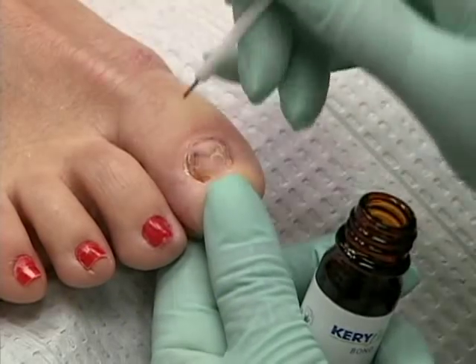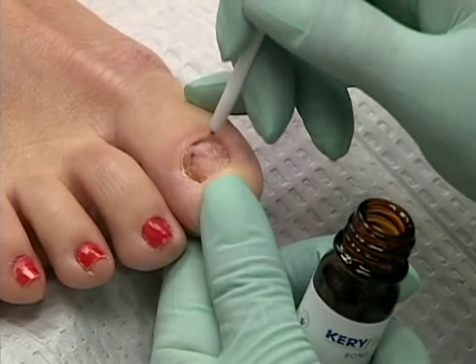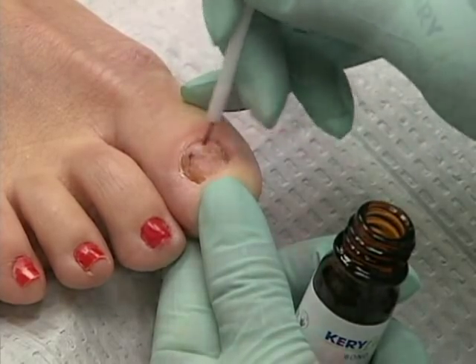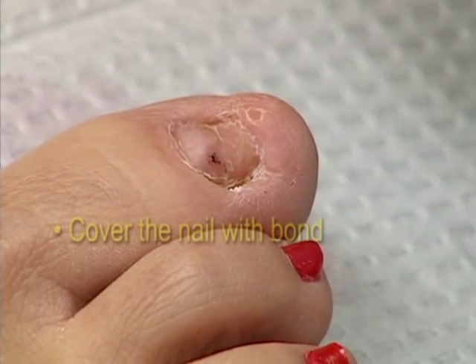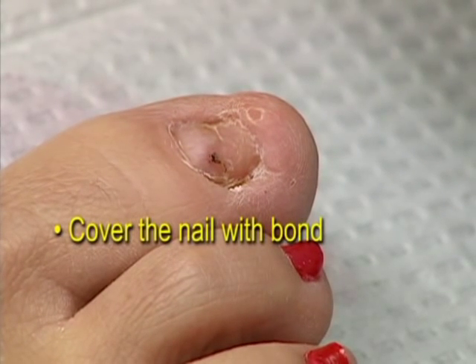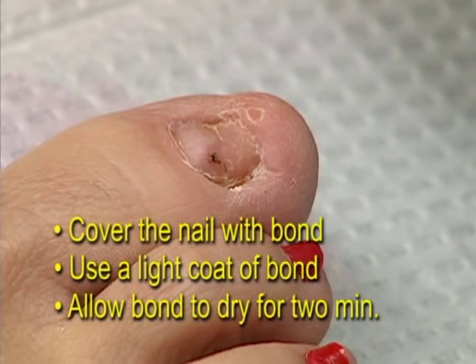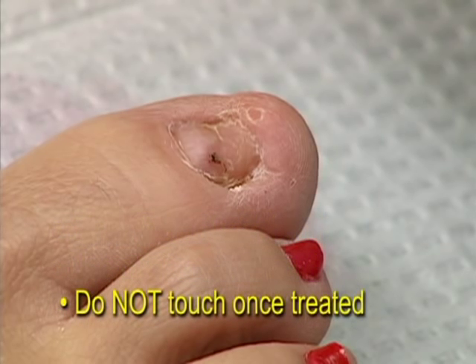The bonding material contains agents that help the resin bond to the surface of the nail and also accelerates the curing of the resin when it is exposed to ultraviolet light. When applying the bond, it is important to cover the entire nail with bond, to use only a light coat of bond, and to allow the bond to dry for two minutes on the nail surface. Be careful not to touch the surface that you have treated with bond, so you don't interfere with the adherence of the resin to the bonded area.